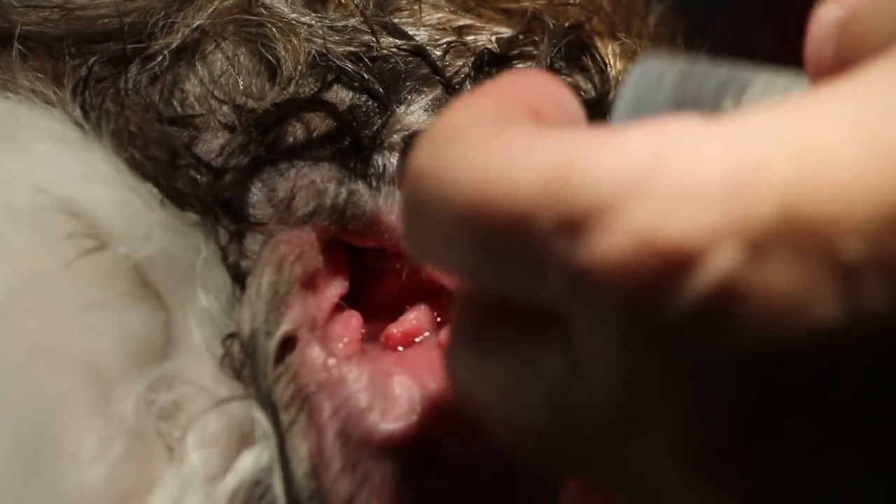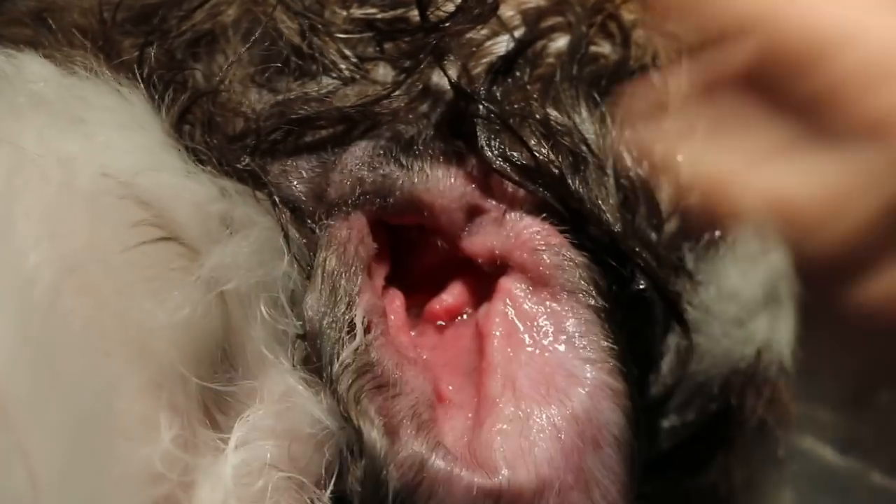If any oil or self-treatment has been applied it's easier in this case. Normally 10 syringes will do. I'll do a quick one on the other side — come over this side, let's do a quick one on the right.